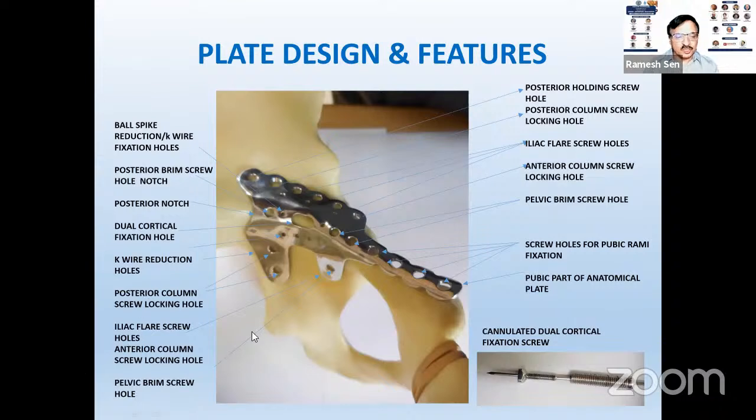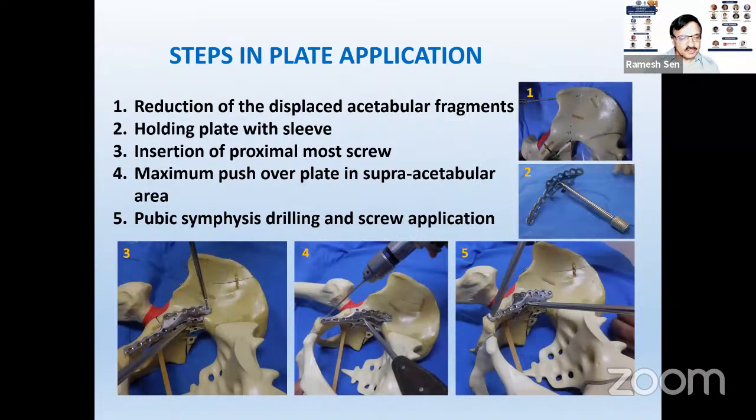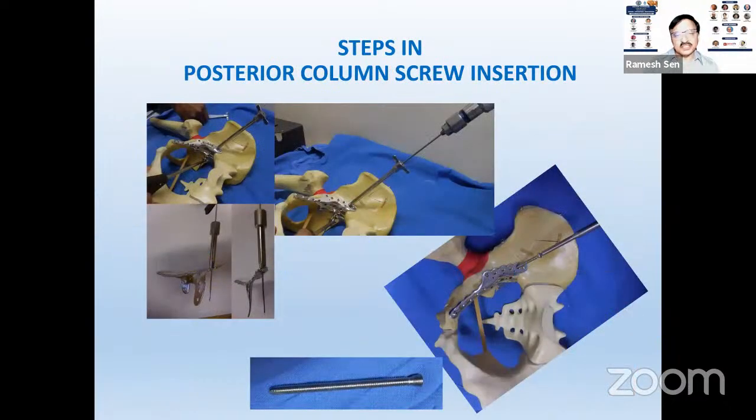We took up a medial buttress at the anterior gluteal line, the posterior line, and a long hole to put a screw outside, a posterior column screw. The posterior screw was developed as advised by Dr. Vivek to go more posteriorly. And then we had an anterior column screw. And this was the nut which we were passing from inside to outside, a nut and screw to give us a better purchase. This was the first proximal purchase, then the cortical screws. This is the concept we worked on, and this way we were putting the posterior column screw, which were specific screws.